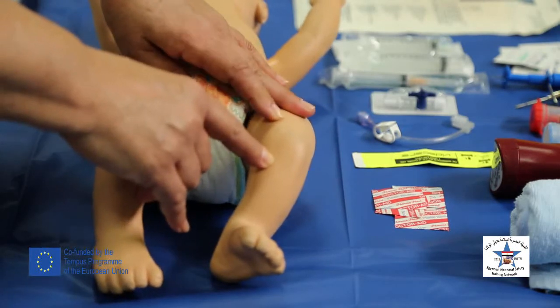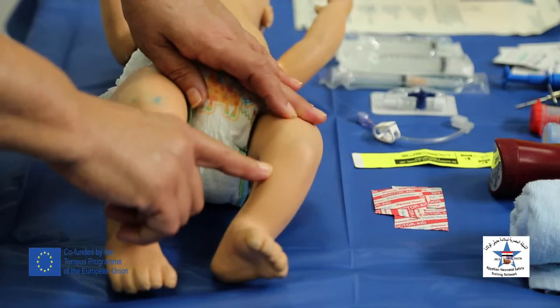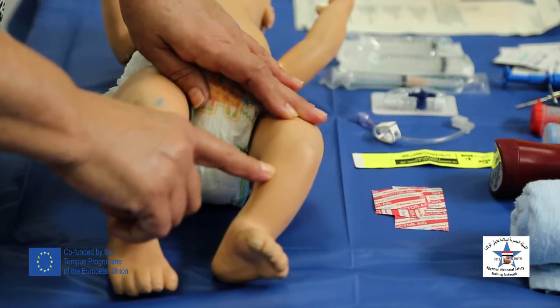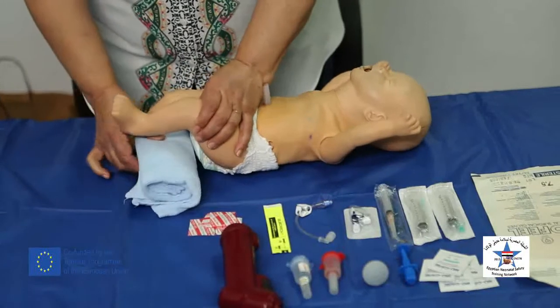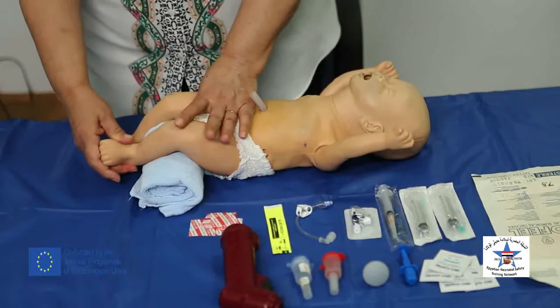Why is this site preferred? Because it is the flat area of the tibial bone where the skin and subcutaneous tissue is not abundant, or is thin. We have to put a rolled towel under the knee of the baby. This will give better support to the area of insertion.